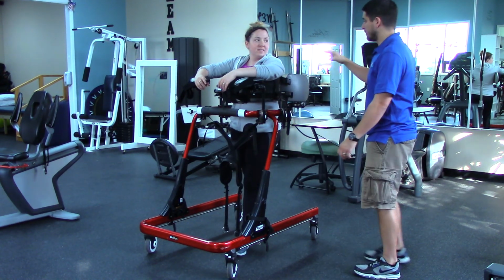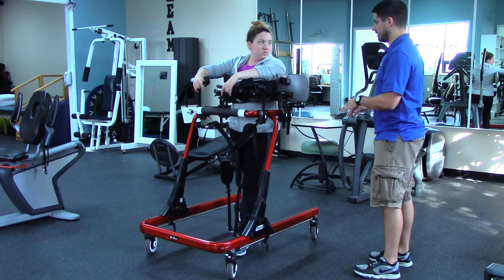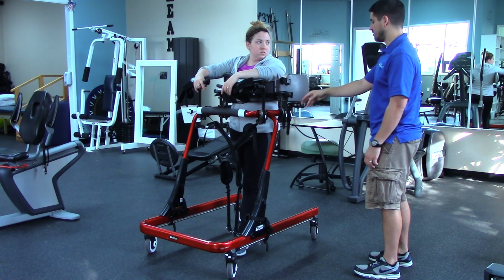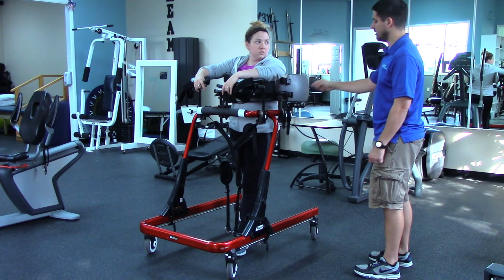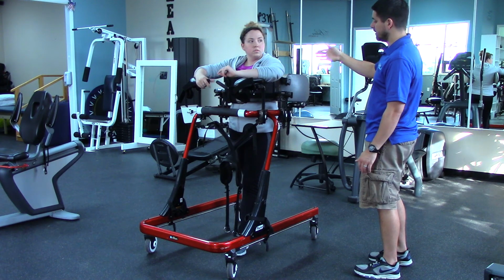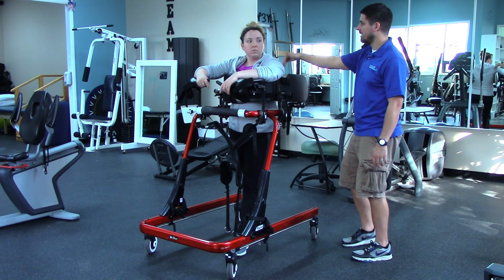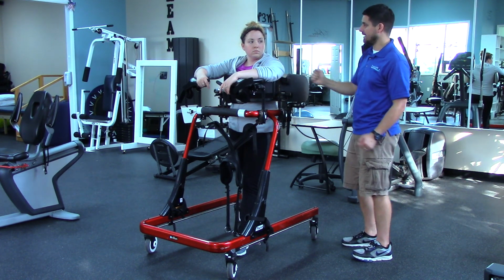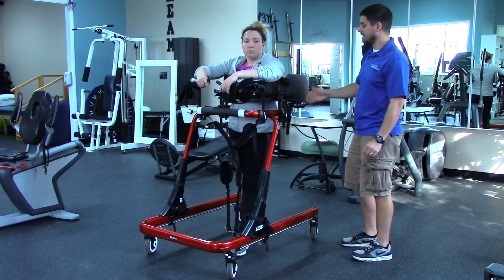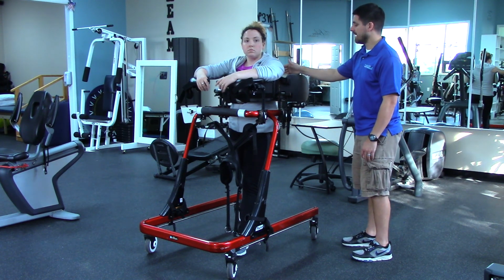Typically, if someone was in a wheelchair and we were getting them in, I would start first with the chest strap, and then try to get the girth strap underneath of them, hook it to here, tighten it and then lift them. Let's say you just stood up from the wheelchair. I'm going to get this in first, especially if you have shoulder depressors. I know that's going to give you at least something that you can hold up on. Let's say your shoulder depressors are weak, then I might get the girth strap underneath first so that you have something underneath of you, and then do this second.